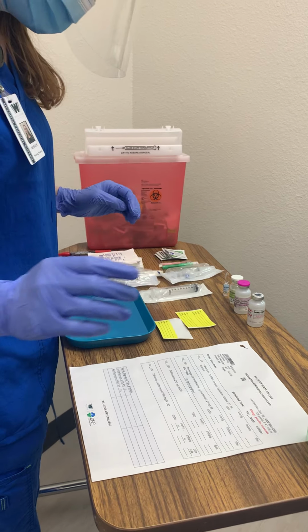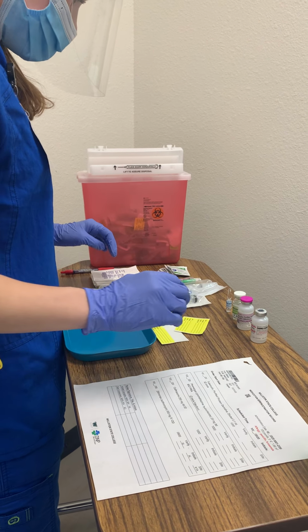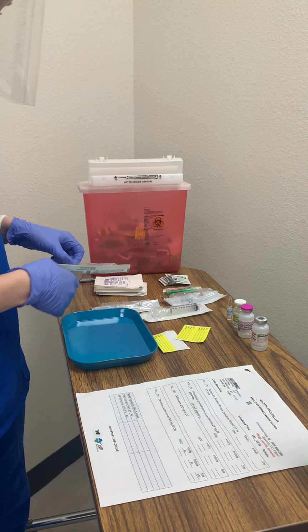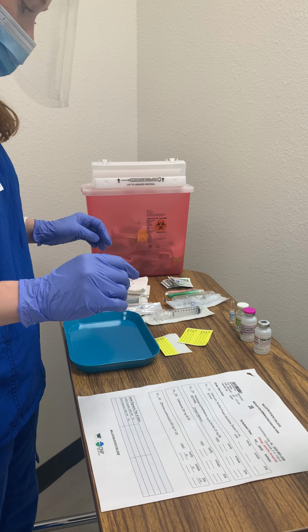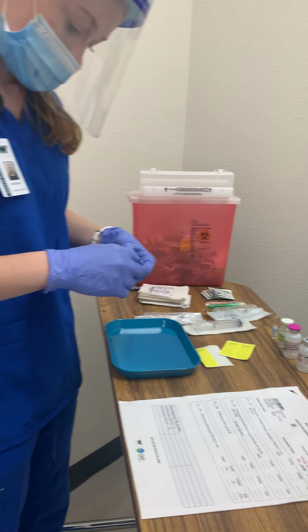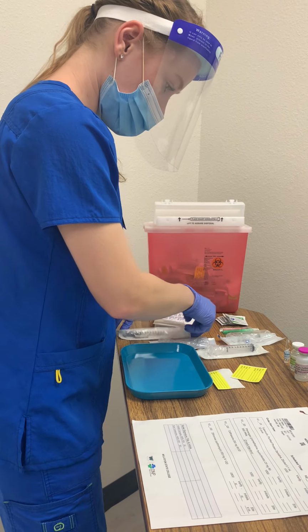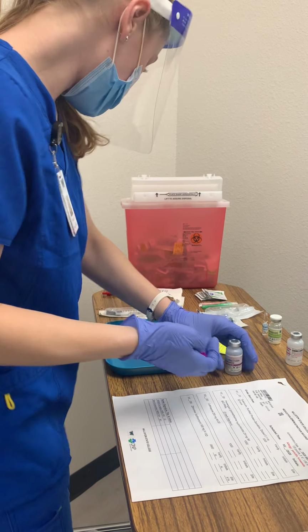So I just got done with my first med, so I'm gonna move on to my second. Actually, I'm gonna do my TB first, sorry. I'm gonna have that package ready, and then uncap my lid.